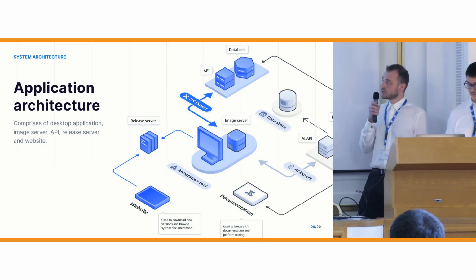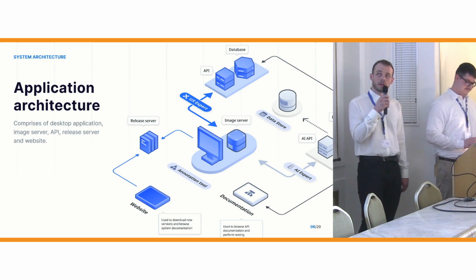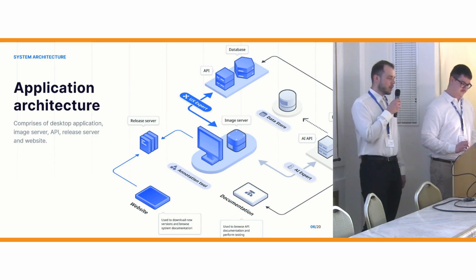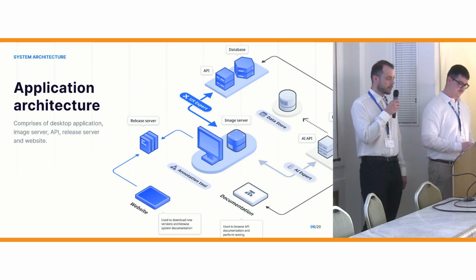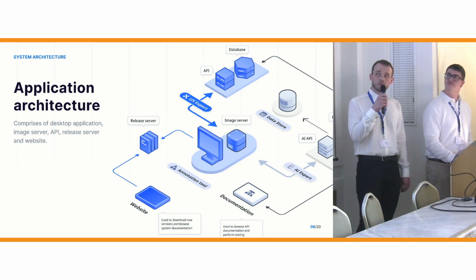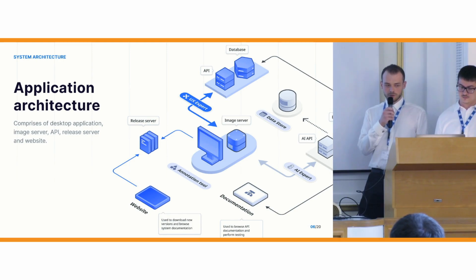The annotation tool consists of two main parts: the annotation tool itself, which is a cross-platform desktop application developed in Electron, and the image server. Next, the annotation tool is connected to the API to store users' data. At the core of the system lies a local image server, which is initiated as a child process of the annotation tool when it is launched and is used for reading images locally. It is developed in Java and utilizes the Bio-Formats library.